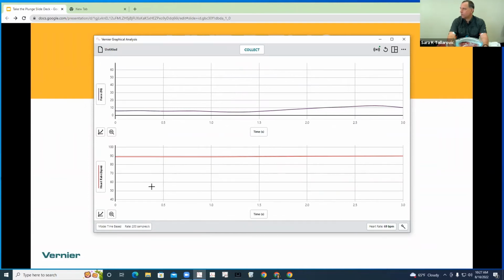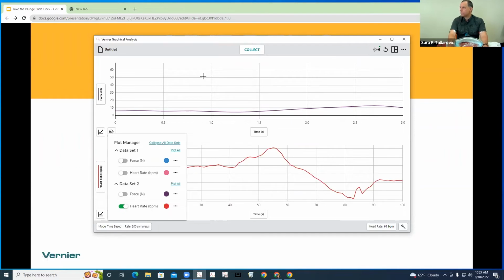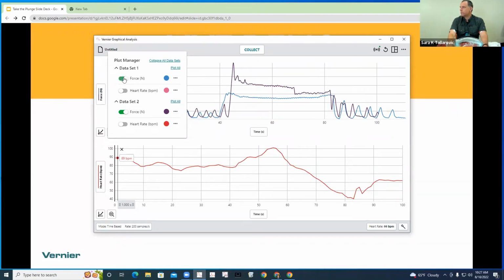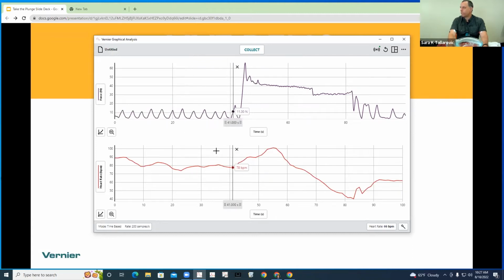We lost our, that was odd. We just lost our Bluetooth. We'll go back to our recorded data there. I'm not sure what happened there. Our sensor lost connection. We might have too much in between us and the sensor. The data's still there though. Yeah, the data are still there. So we can just start a new session when it's time.